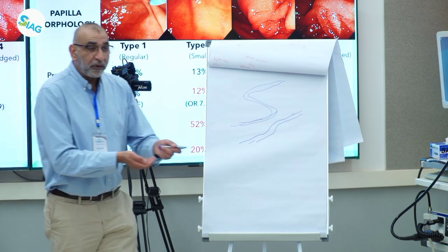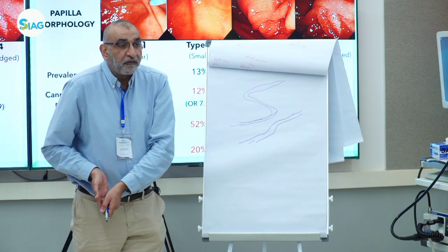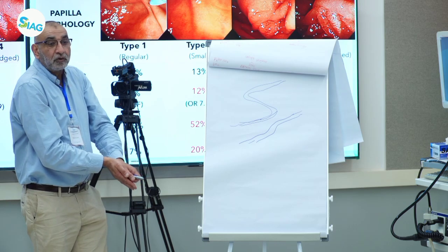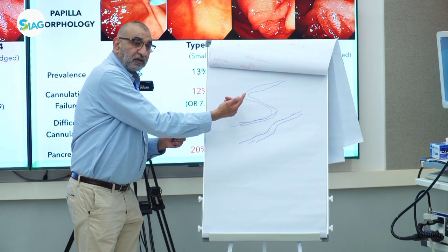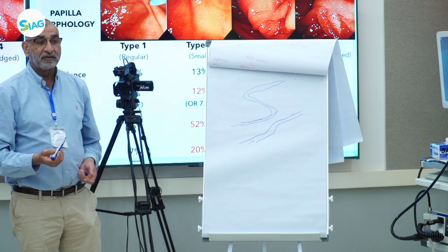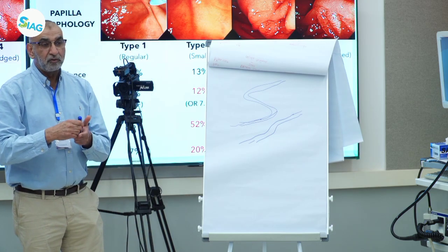When you push the scope in, it pushes the tip back for you. So that will straighten this S out. In that situation it will straighten it out and then the wire will go. Otherwise, you end up doing three quarter.